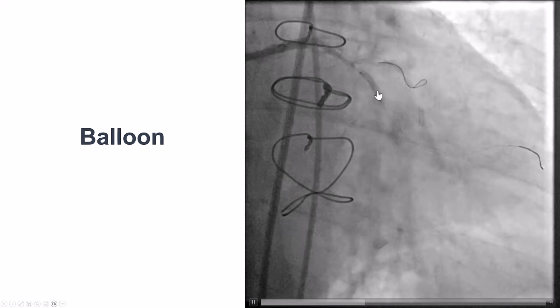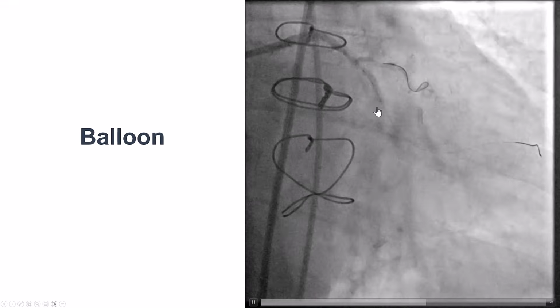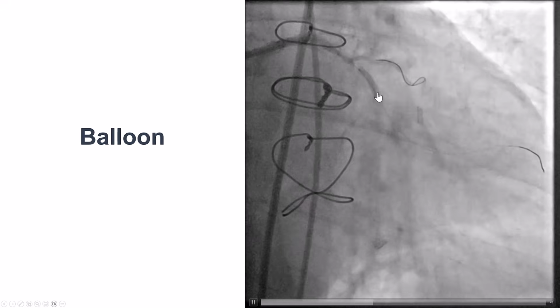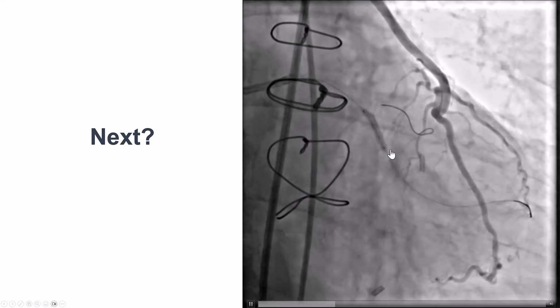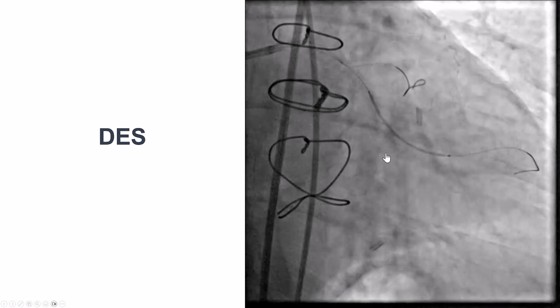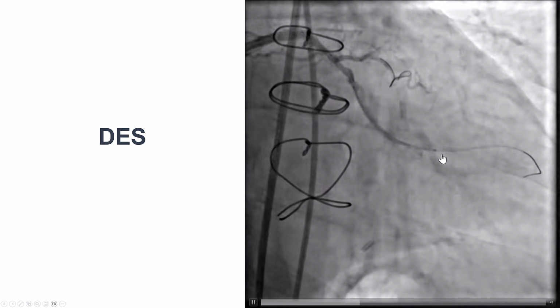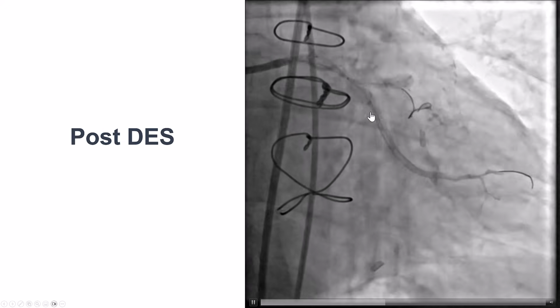How to fix this? Like every perforation, the first step is to get a balloon, achieve hemostasis, which is what we did. This perforation here was done while we're trying to go extraplaque, and we had true lumen. So we thought that if we placed the stent, we might move the dissection plane and seal the perforation. And this is what we did. We placed two drug-eluting stents, one going into the second obtuse marginal, and the other one coming a little further up.